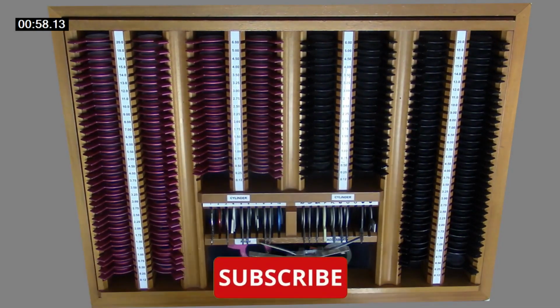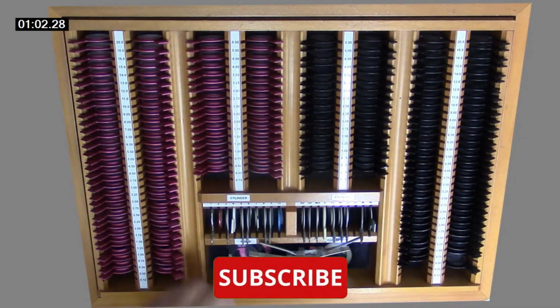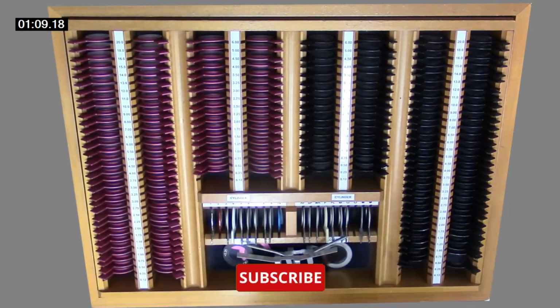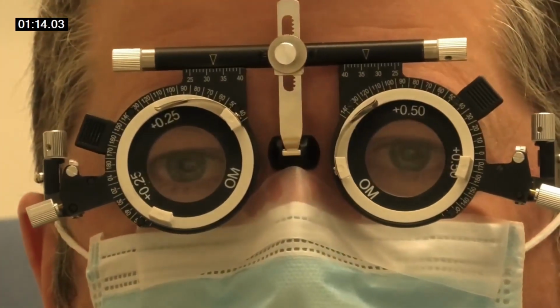Plus 0.25, so that's that one. Plus 0.50, which is that one. Let's get rid of that. Okay, now that's fine. Right, so let's have a look.